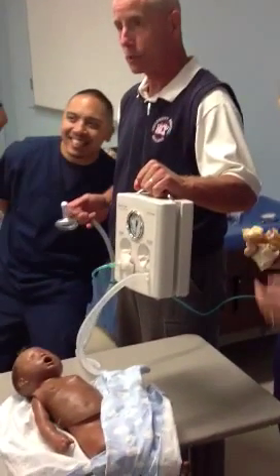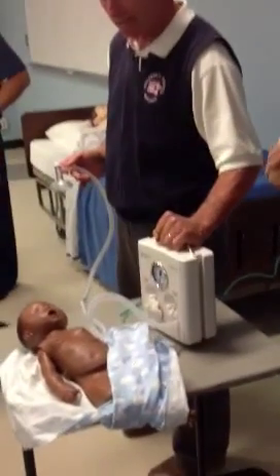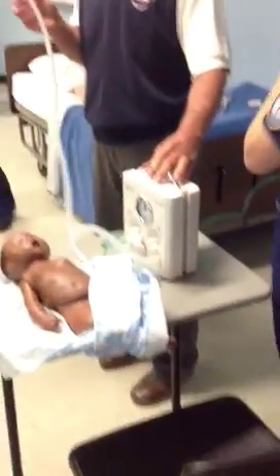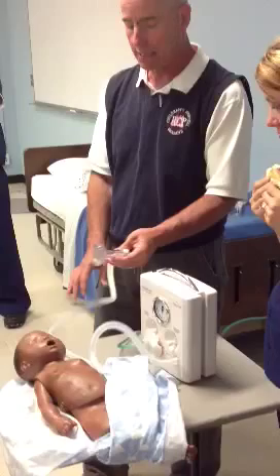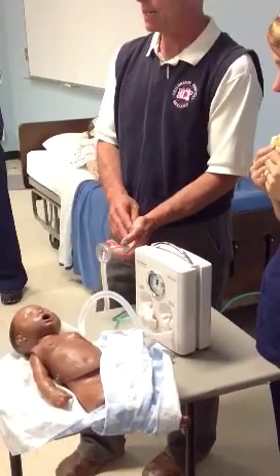Right now, the Neo-Pep — it needs a compressed gas source, remember? Let's talk about the advantages of this device. Can it provide CPAP? Yes. Can it provide blow-by? Yes. Can it function without a gas source? No.